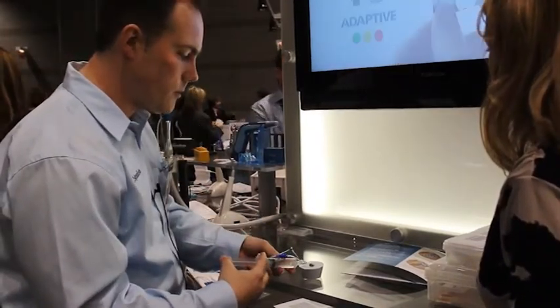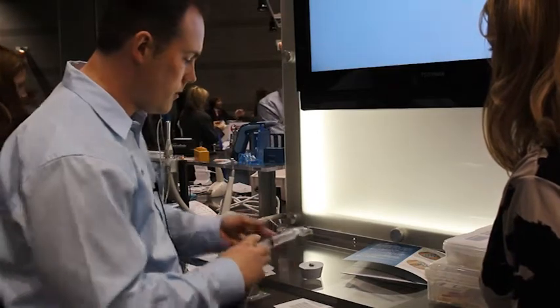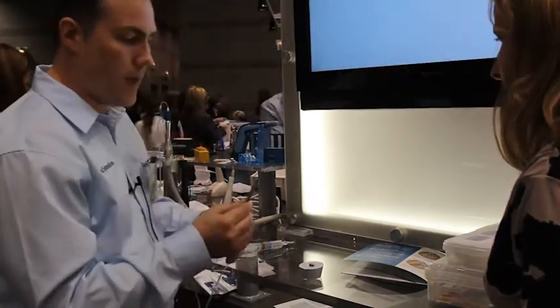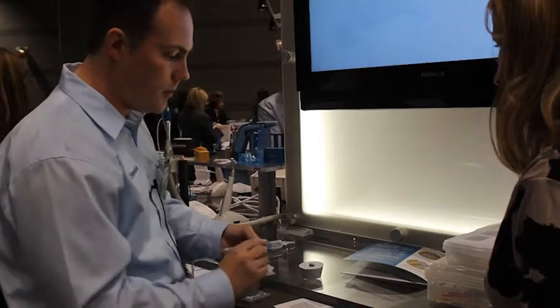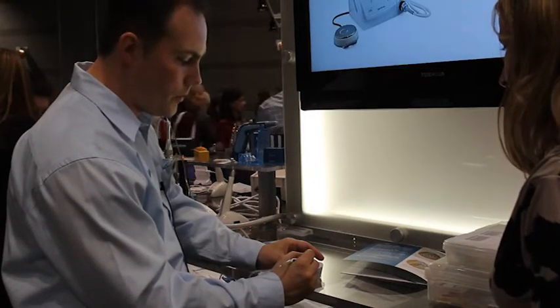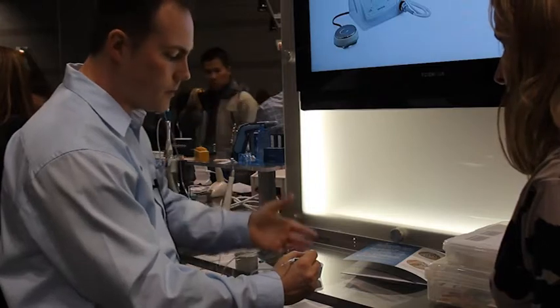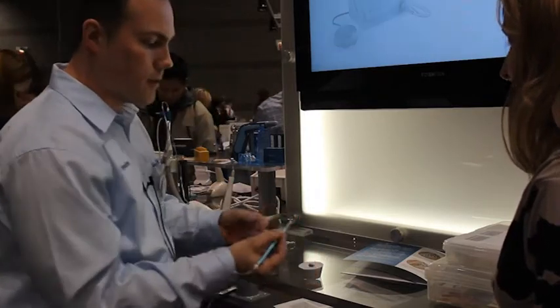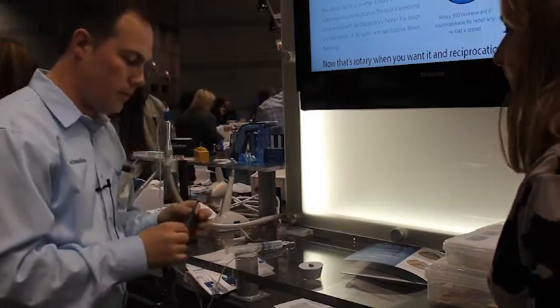We'll apply again some sodium hypochlorite, and we've got our macro cannula and our wand hooked up. We'll just simply go into the canal, hold for 30 seconds. We're removing that debris and everything necessary to get out of the canal with our macro cannula.